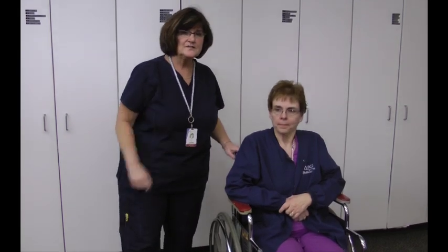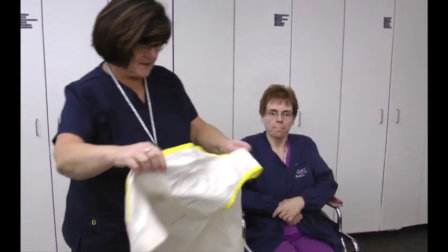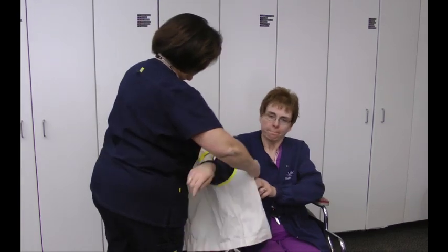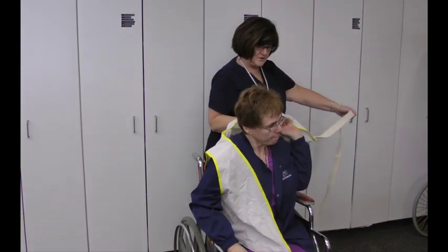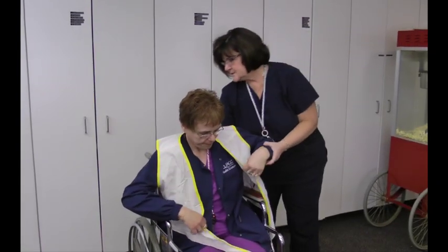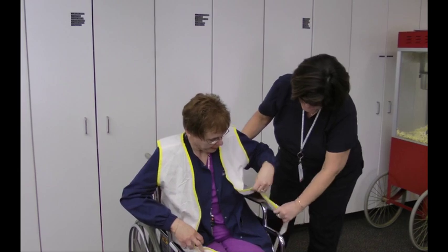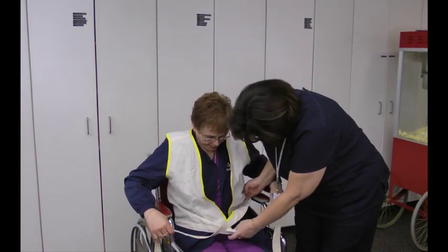Okay? The last one I want to show you is the vest restraint. A little bit more technical, but it's going to go on and cross again. So Melissa, we're going to ask you to put your arm through there. Okay? Put it around. It's got big long strings on it. Good job. Pull it down in the back. The long strings, they go through this one.